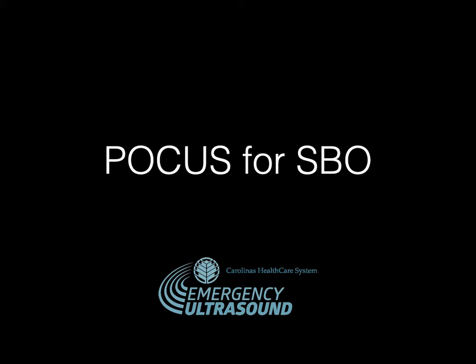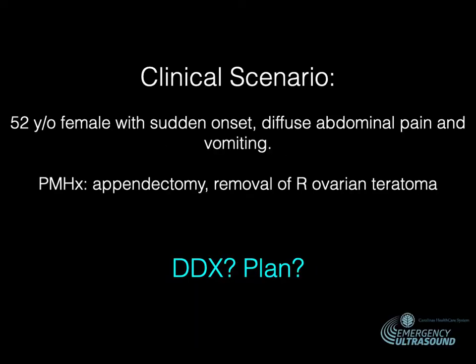Hi all, so today we're going to talk about using point-of-care ultrasound for screening for small bowel obstruction. So you're working in the emergency department, it's really busy, CT is backed up, and you have a 52-year-old female who comes in with sudden onset vomiting, diffuse abdominal pain. She's writhing around on the stretcher, she's obviously in a lot of pain, and she is just profusely vomiting everywhere.